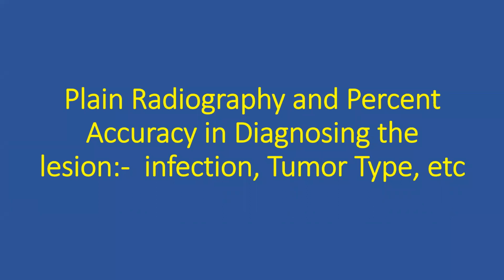Plain radiography and percent accuracy in diagnosis has helped us in identifying lesions, infections, or tumors. Let me tell you, fellows, I refuse to review an X-ray, a radio imaging, asking me, is this a tumor, without seeing a plain X-ray. We can identify what the lesion is in 70% of the cases. You have to keep this in mind, young people.